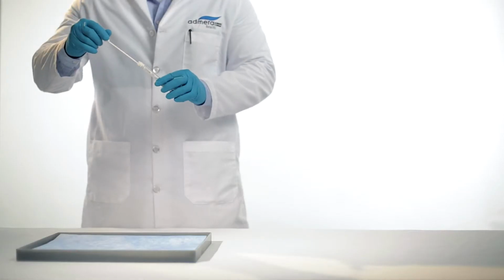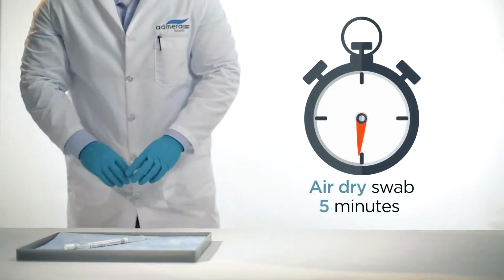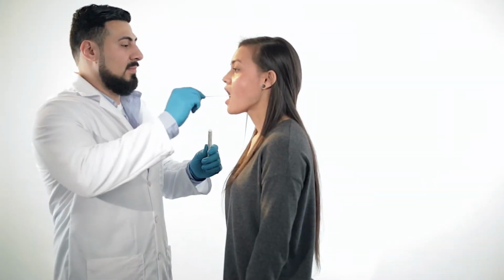Carefully reinsert the buccal swab into the clear plastic tube, leaving it partially open to air-dry swab for 5 minutes. Once dry, press the cap firmly to secure. Repeat with second swab using alternate inner cheek and gum.